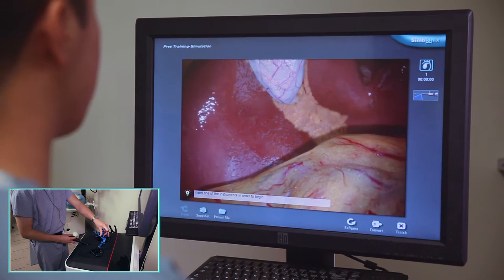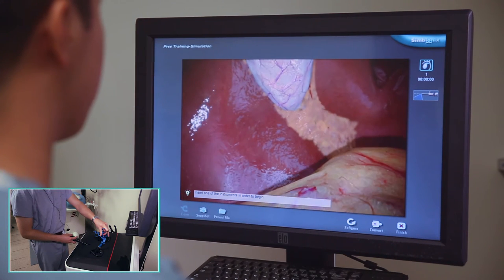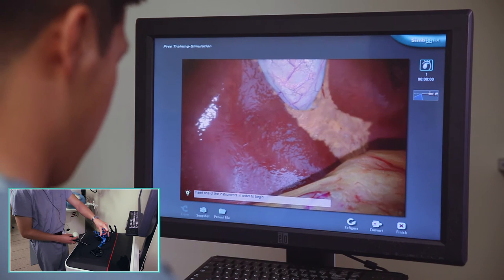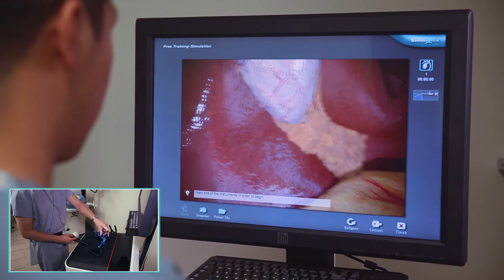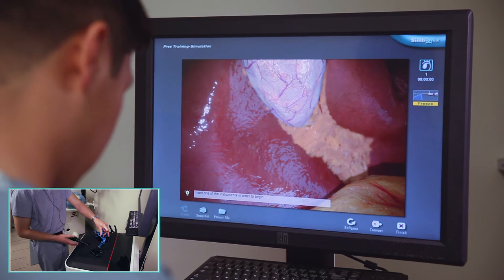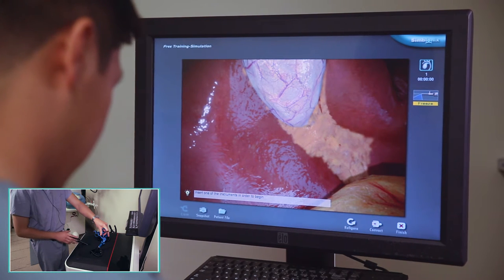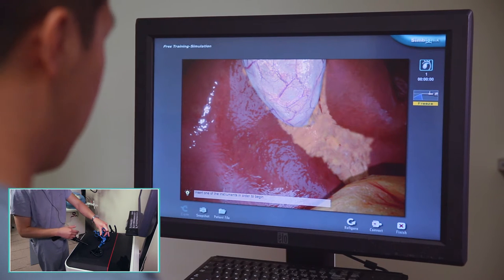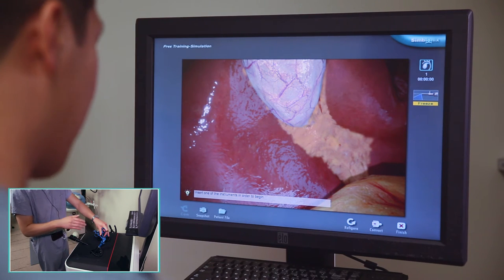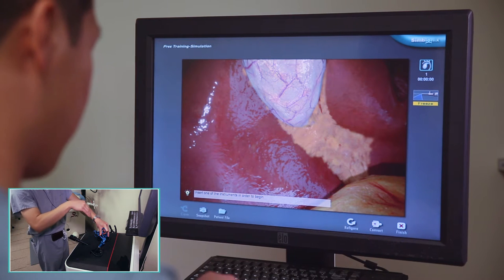Let's get started with case one of the laparoscopic cholecystectomy. First thing I'm going to do is position my camera. I'm going to be using the 30-degree down scope. The important thing to remember with the scope positioning instrument is that the green dot represents your light cable coming into your scope. So if it's coming in at 12 o'clock, your 30-degree angle is going to be pointed downwards.